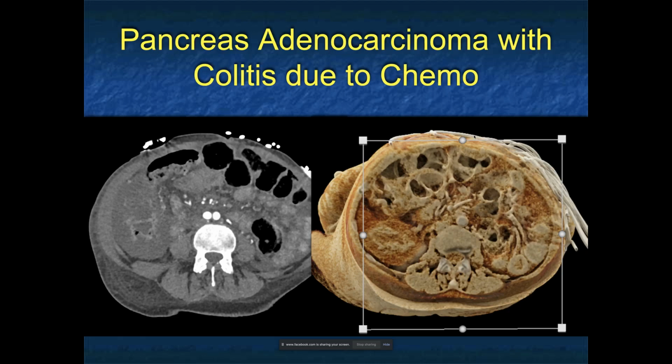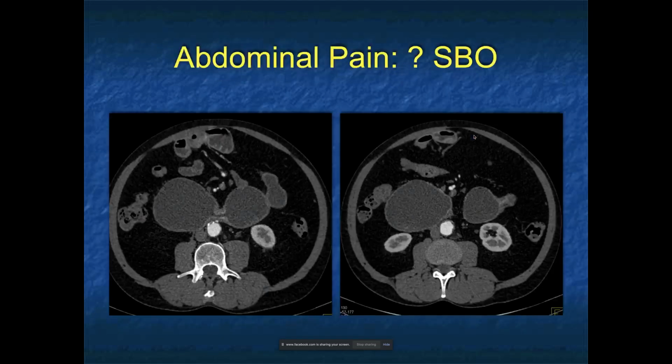One of the things I've noticed is that patients at times have colitis that's extremely impressive on the CT, but not so impressive symptomatically. So it's not always a one-to-one between symptoms and the CT appearance. So that's important to remember.